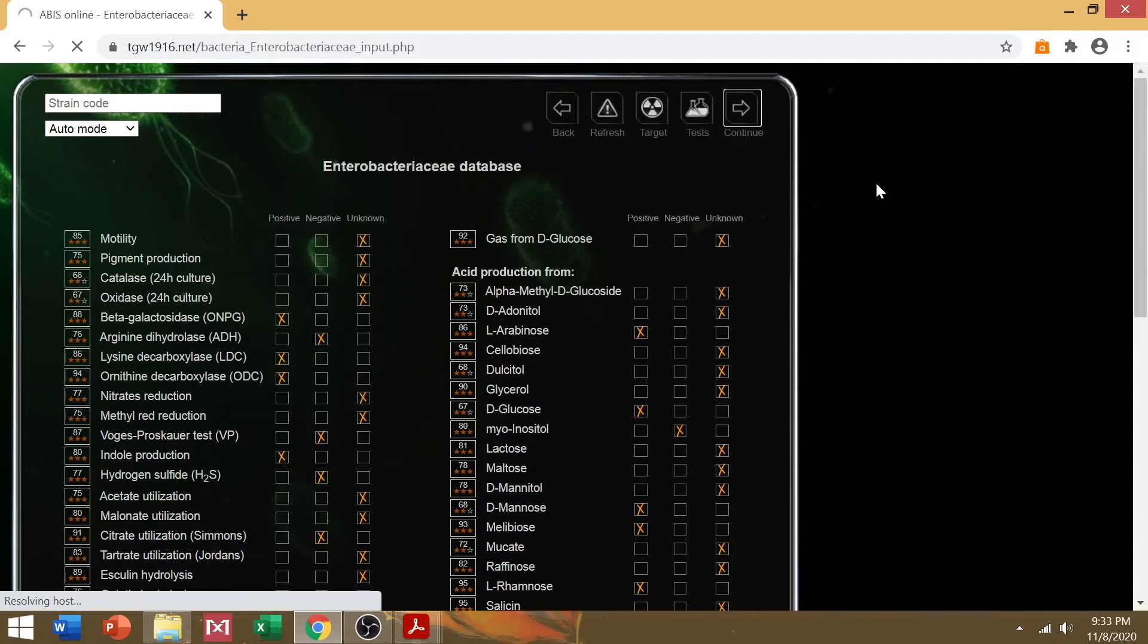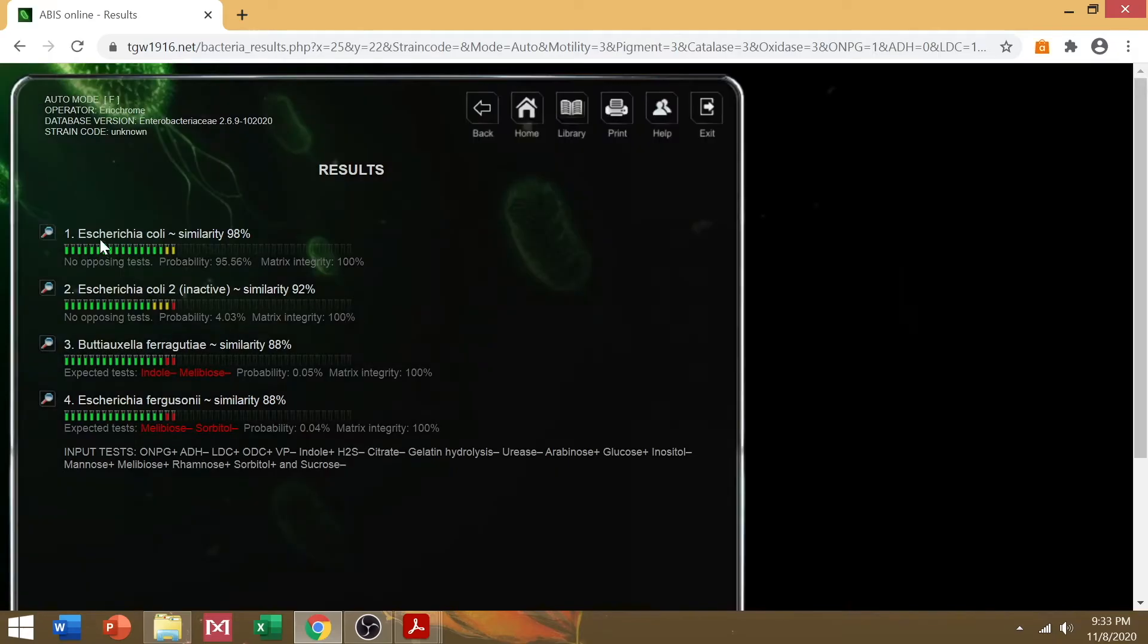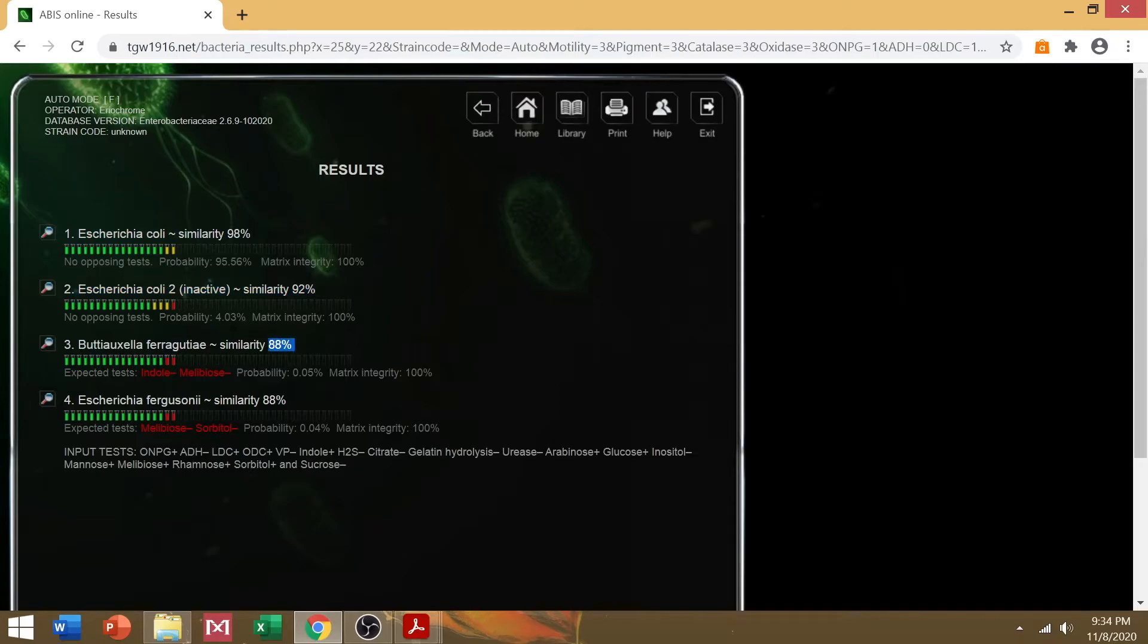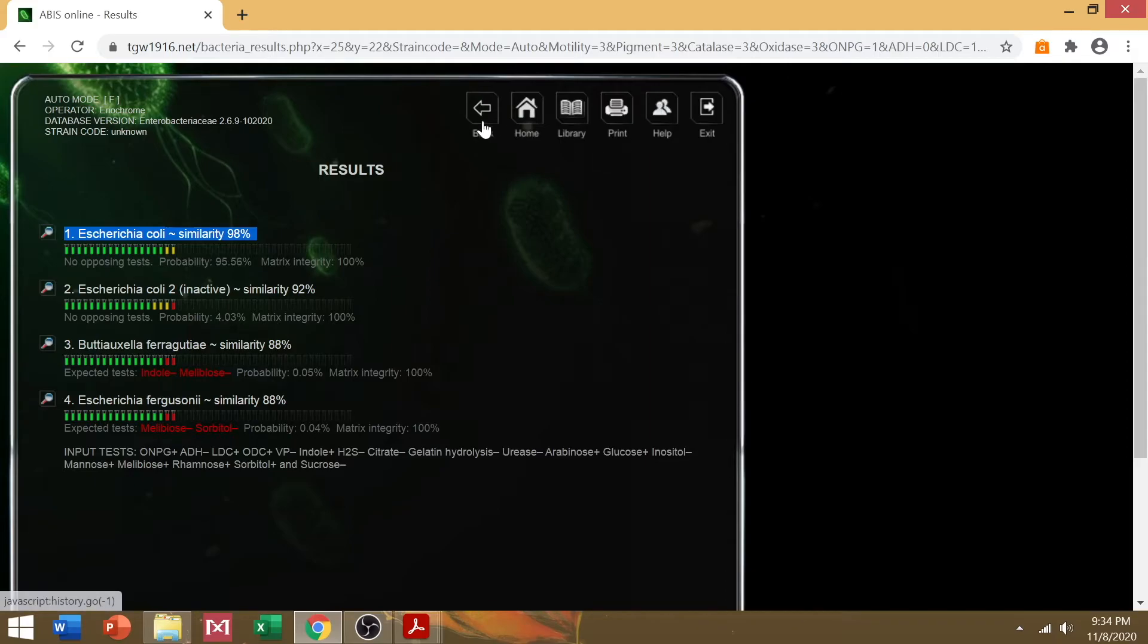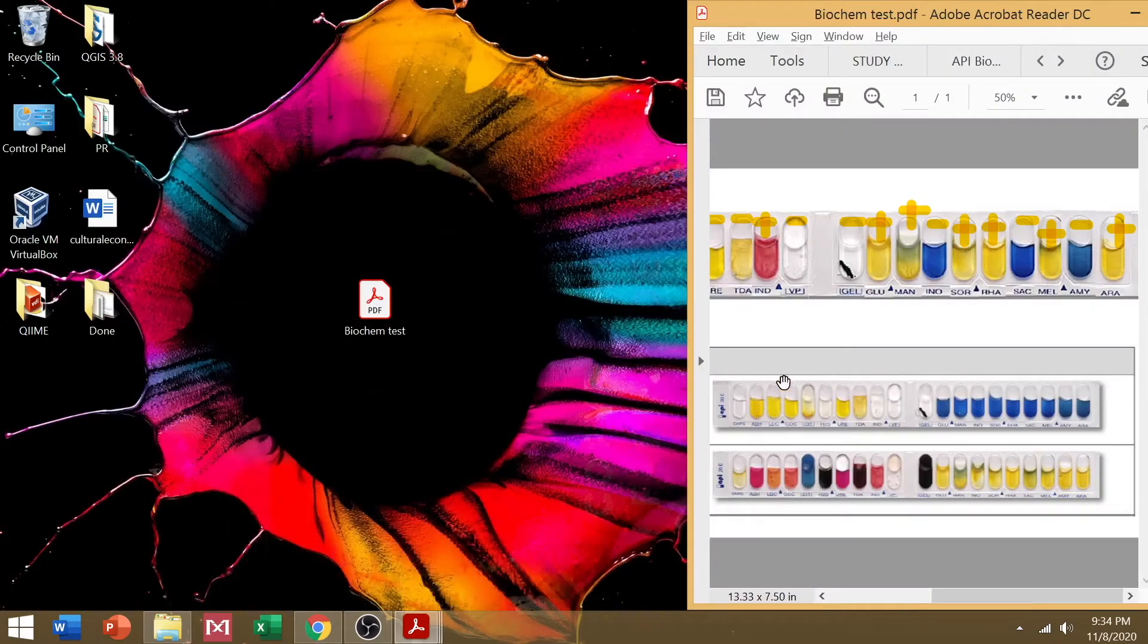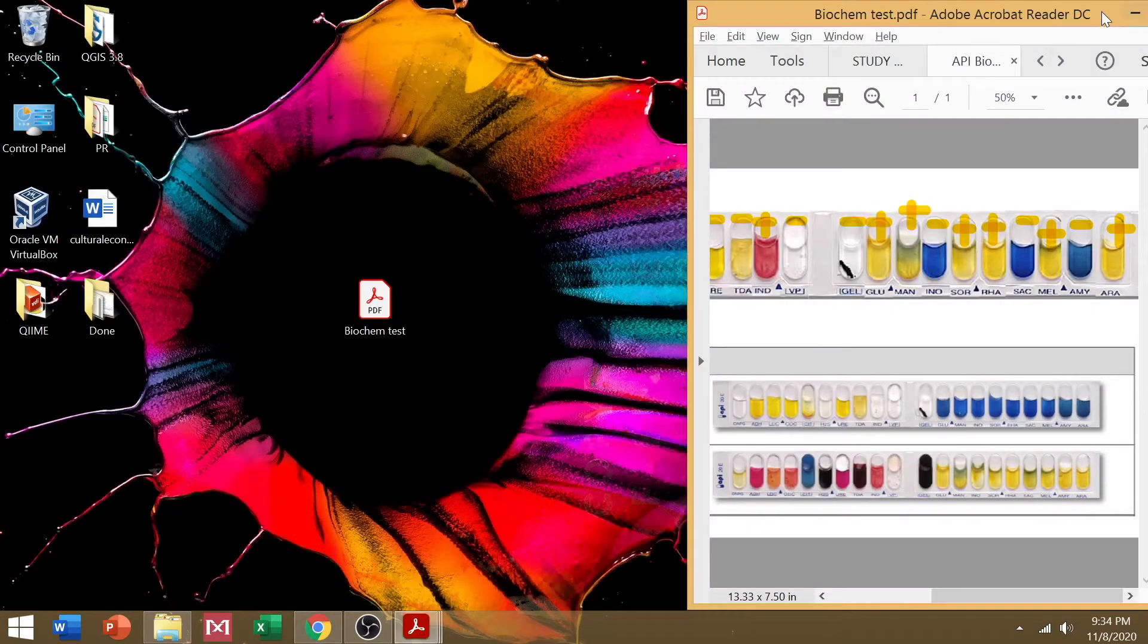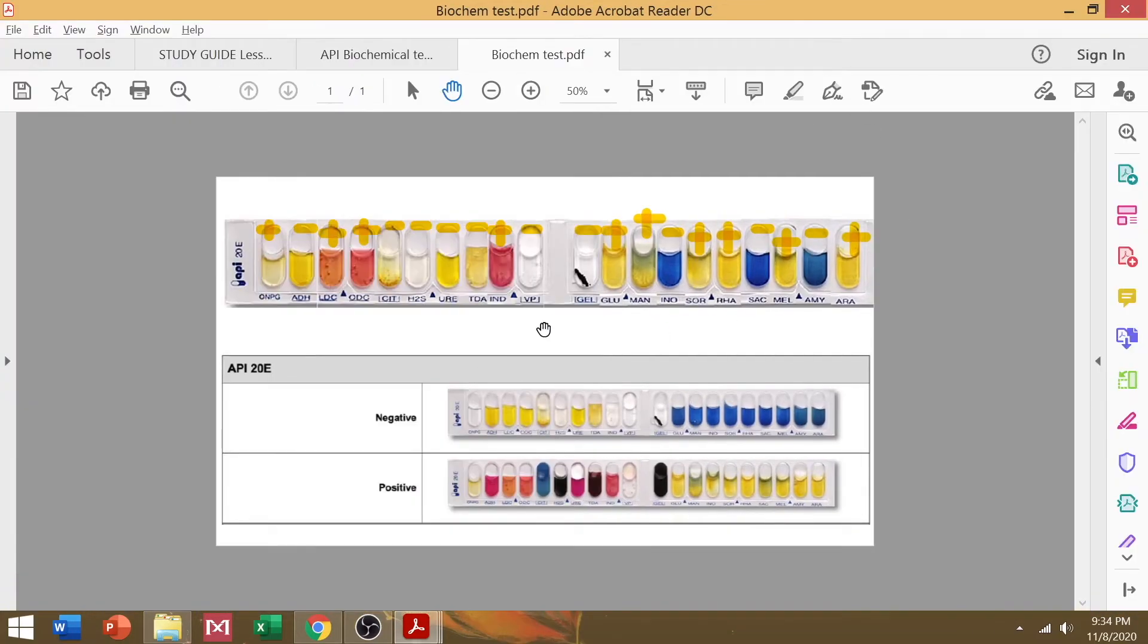After clicking continue, just wait for a few seconds and the bacterial identity of your isolate will come up. So I need you to screen cap this plus the tick system that you have created, all the ticks that you ticked, so that you can include it in your discussion in the paper.